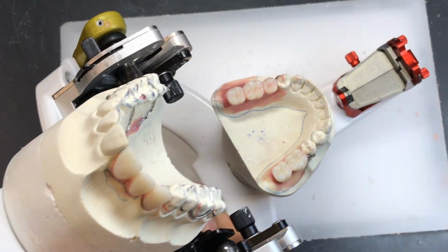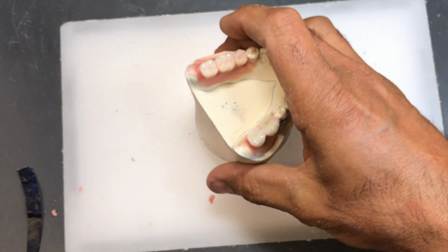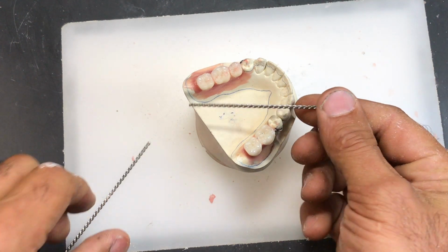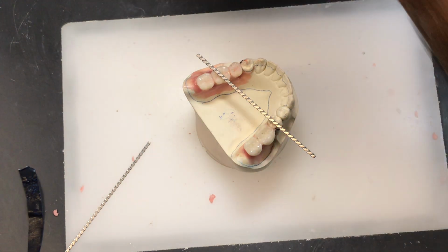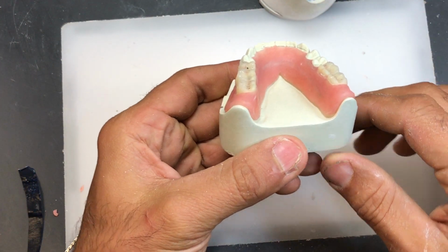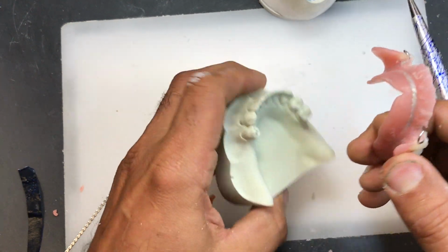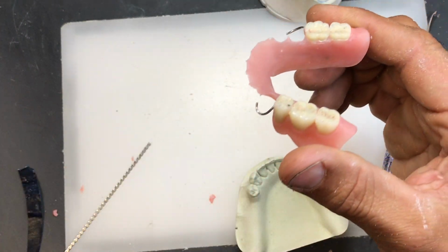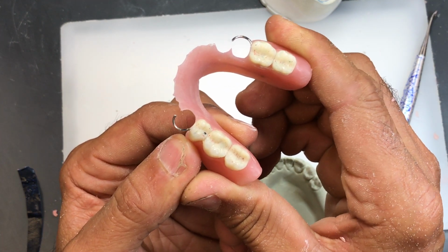We're also going to incorporate a strengthener on the lower model of braided wire. So we're going to take a piece of braided wire like this, and we're going to incorporate it on the lower cast. So by the time we finish the case, that braided wire is embedded within the acrylic base and looks like that. And this provides strength because this here has a very weak point where you can almost see it, I can almost flex it, it could break. But the wire provides a little more resistance and holds things together.